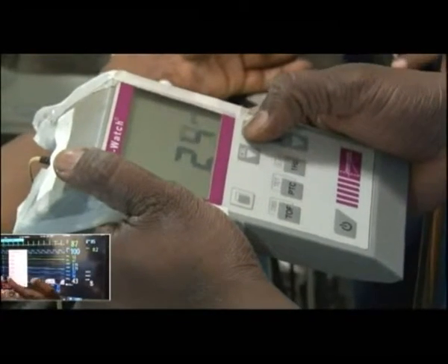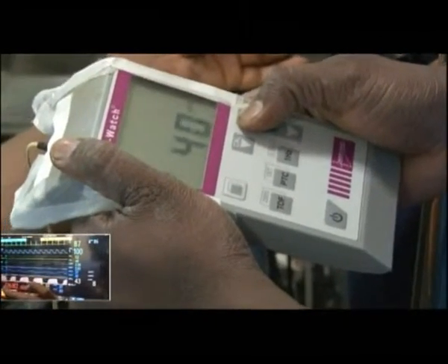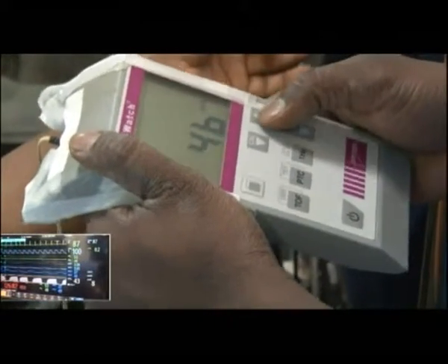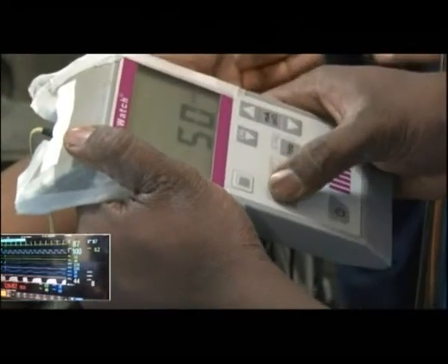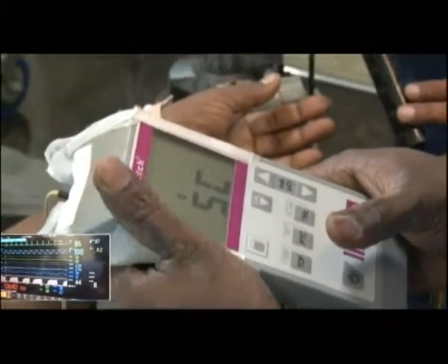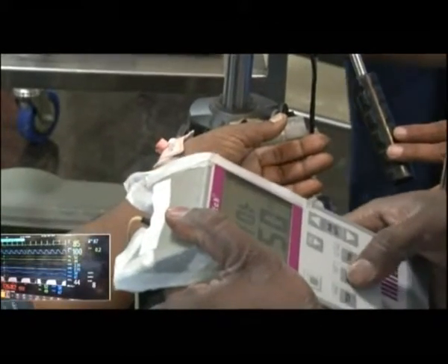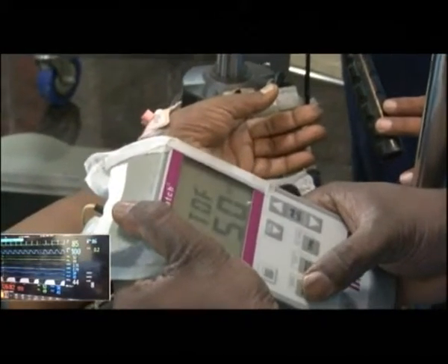Maximum 70. So we are going to use maximum, obviously, twitch. How much total atracurium did you give? 50? 50. Yeah. No twitch.